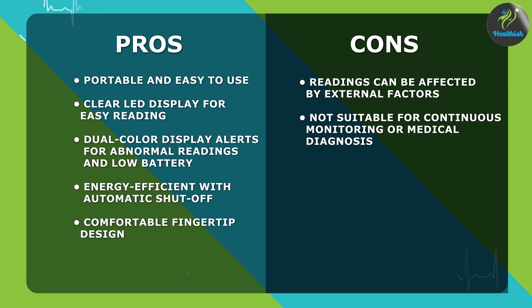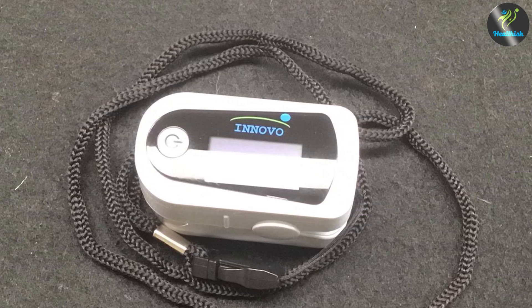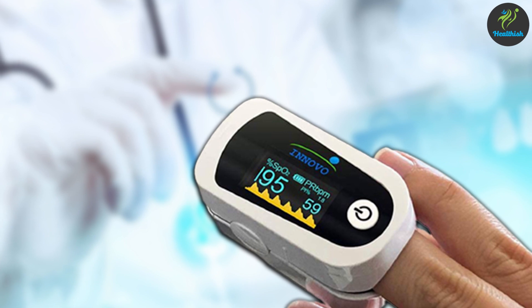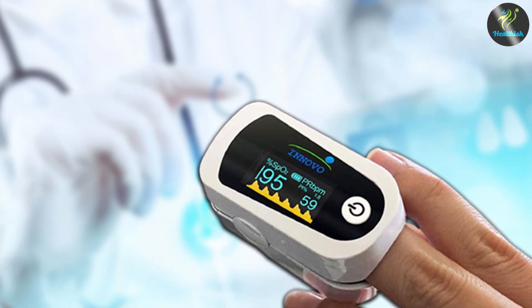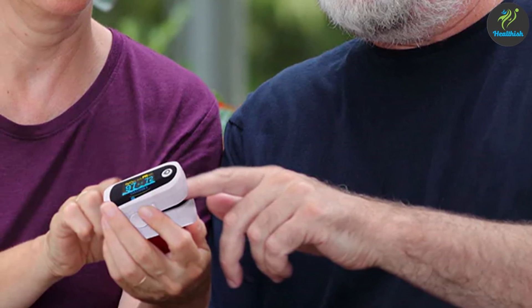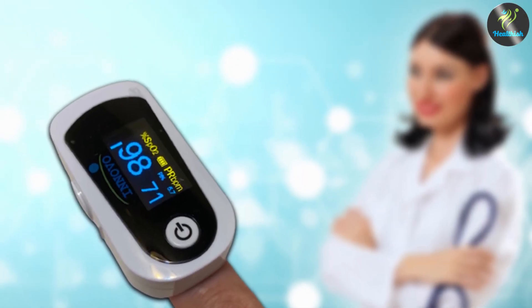The Innovo Premium IP900BP Fingertip Pulse Oximeter offers a user-friendly and reliable solution for monitoring your blood oxygen saturation levels and pulse rate. Its compact design, accurate measurements, and clear LED display make it a valuable tool for those who need to monitor their SPO2 levels regularly. However, it's important to remember that this device is not intended for continuous monitoring or medical diagnosis. Always consult with your healthcare provider for any concerns or medical advice.